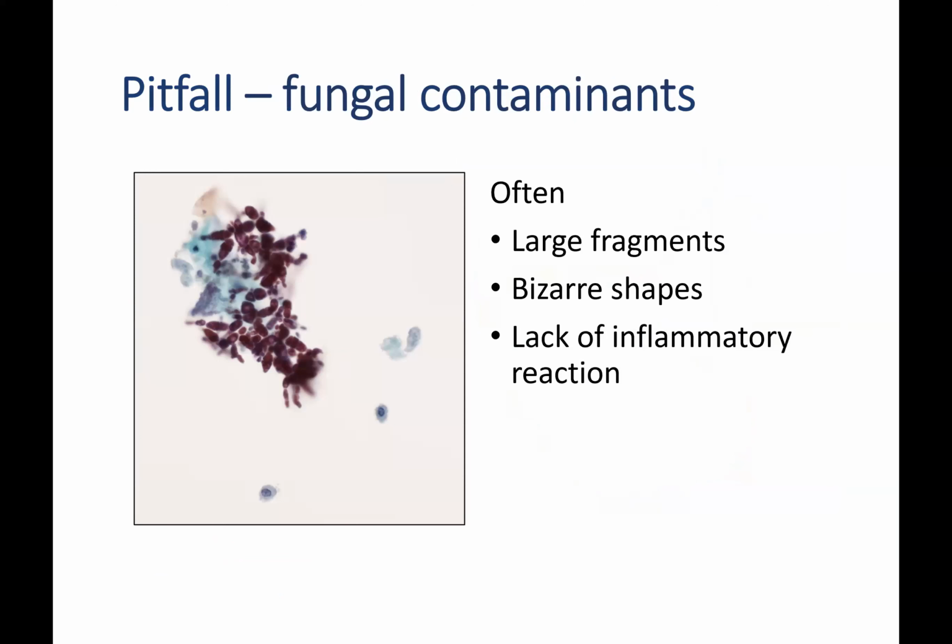On the subject of organisms, beware not to attribute any significance to fungal contaminants, especially if these are large, bizarre-shaped fragments and there's a lack of an inflammatory reaction.